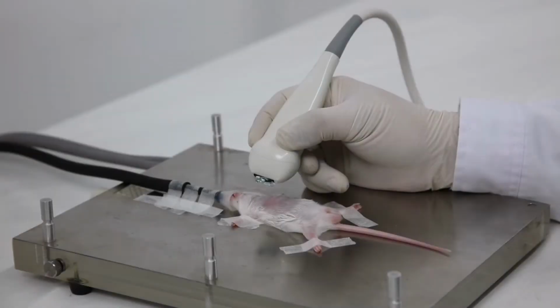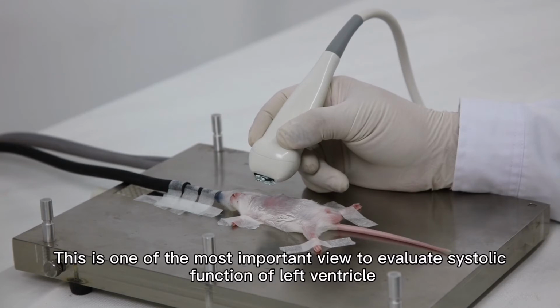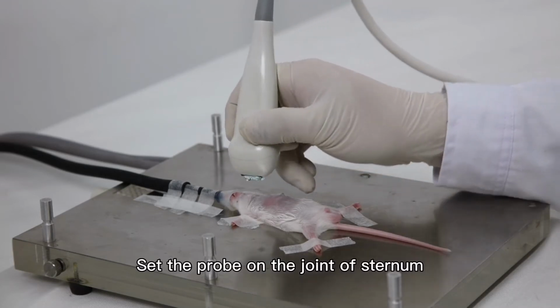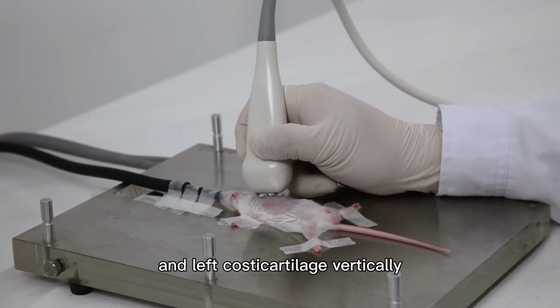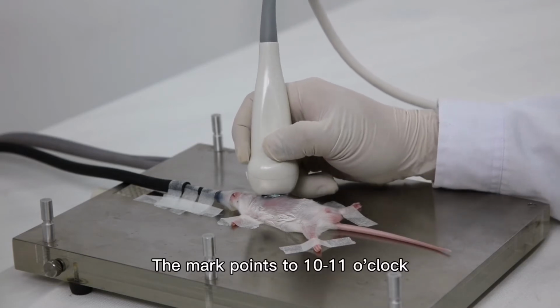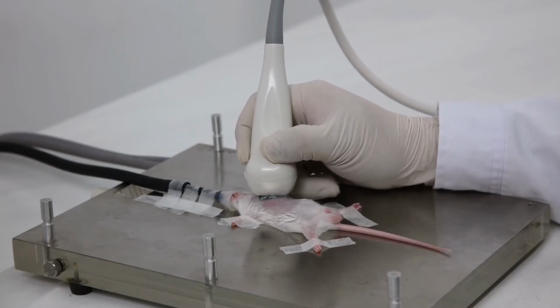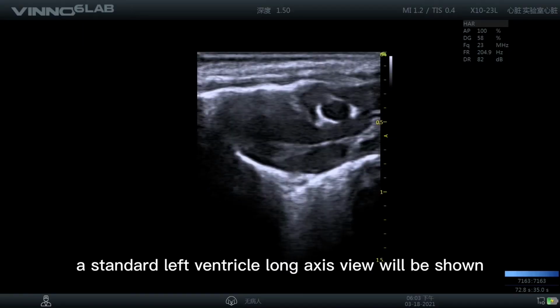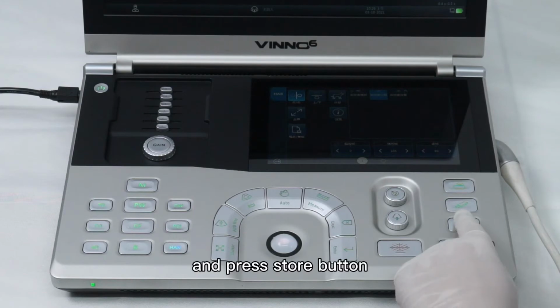Long axial view of the parasternum. This is one of the most important views to evaluate systolic function of the left ventricle. Set the probe on the joint of sternum and left costal cartilage vertically. The mark points to 10 to 11 o'clock. Adjust the probe slightly. A standard left ventricle long axis view will be shown. And press store button.